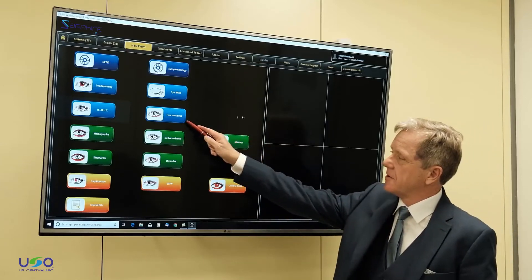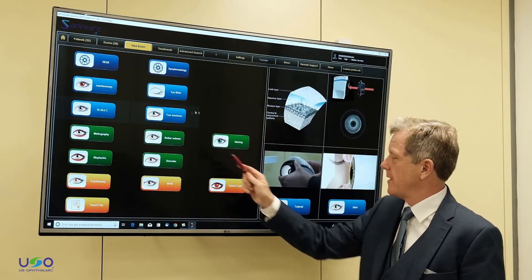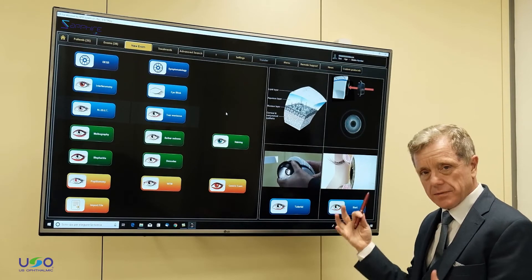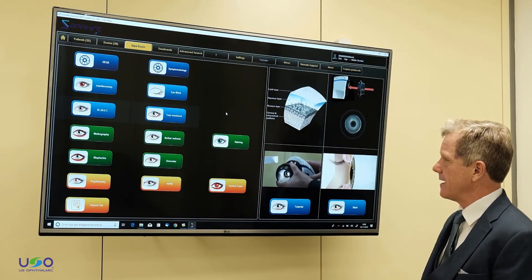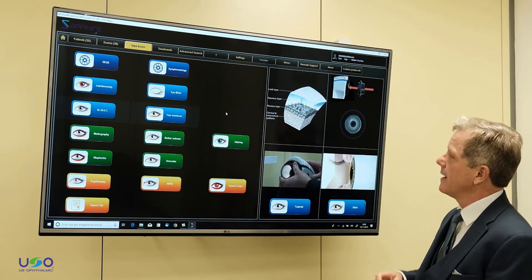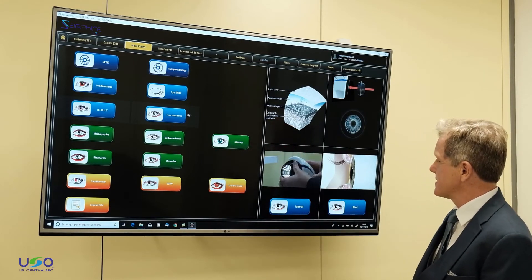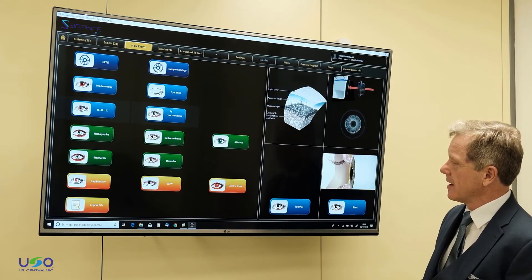Let's go to tear meniscus here and click on that. This shows you the Placido Ring device again, and we double click on the tear meniscus to take the information.